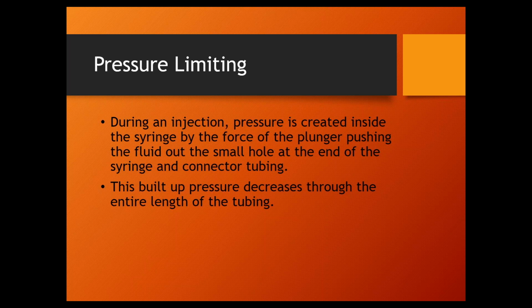Now that pressure buildup is in the syringe. It's not in the connector tubing. It's not at the patient. So for typical CT and MRI injectors, 300 psi is the typical pressure limit that they're asking for. All right, 300 psi. Now again, that is not in the patient.